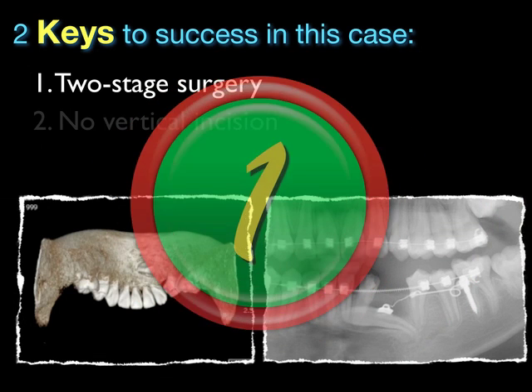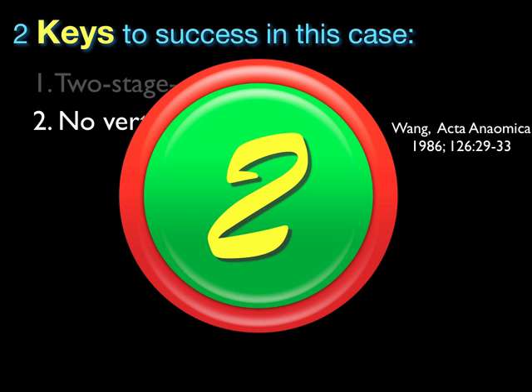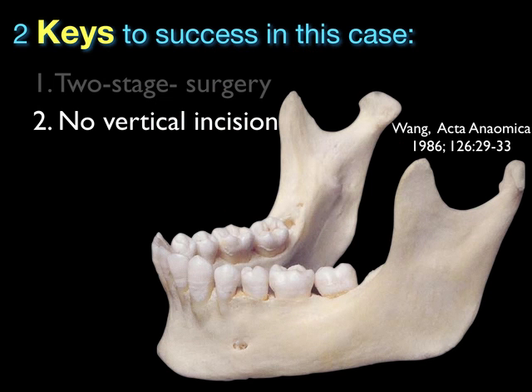So I'm so happy. I want to give you 2 keys to succeed in this case. The first one, you have to remember this: 2-stage surgery. Number 2, no vertical incision. Why do you want 2-stage? Because you want to have minimal invasive surgery.